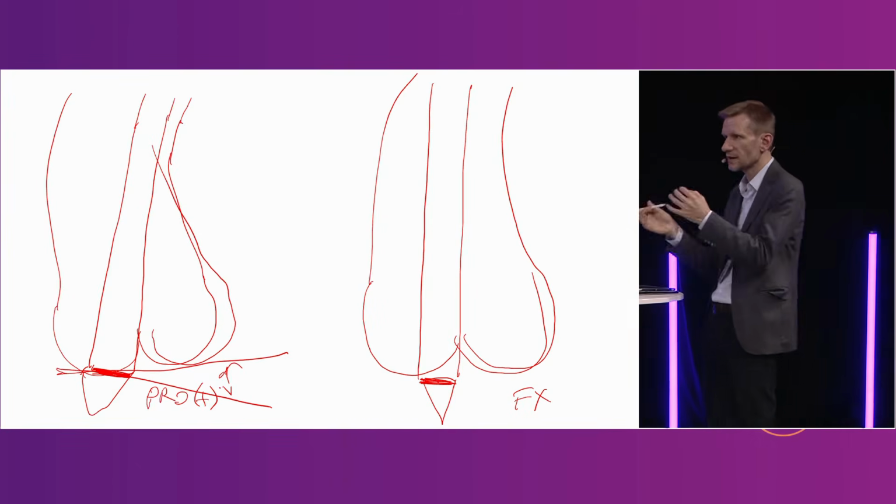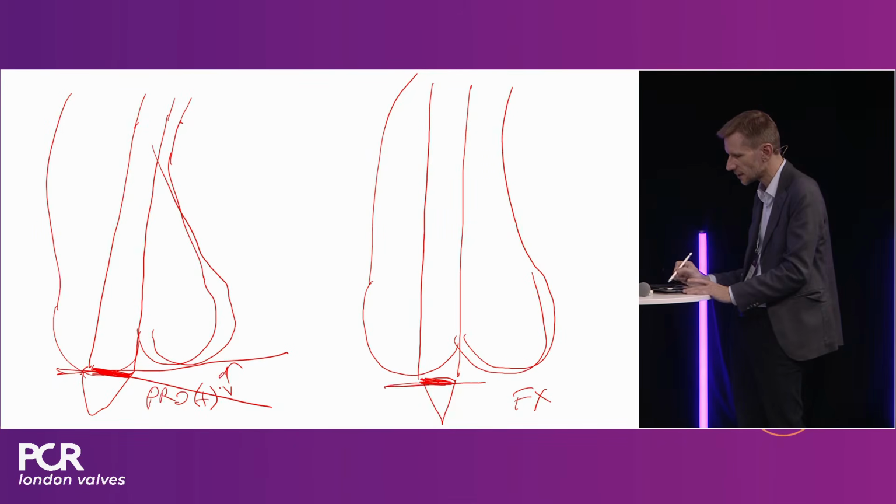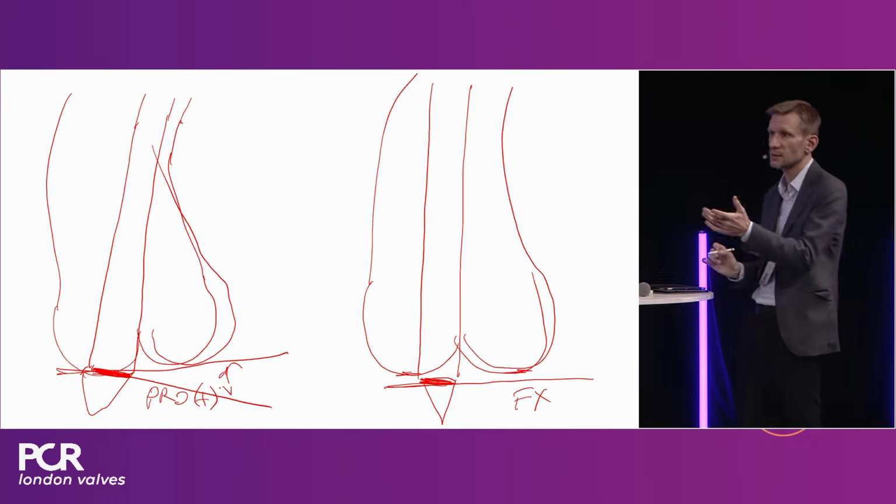But now, because you have that more flexible catheter, I think it arrives, in the cases that I did, more kind of vertical, but then if you even expand, it tilts in a good way, so you can actually deploy more centrally, equally, symmetrically. That's also what Gilbert Tang's data shows.